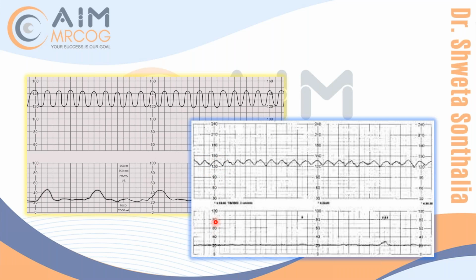And even if you can't read this, you start from 60. So 60, 80, 100, and then this is 120, and this is 140. Between 120 and 140, it is almost half of the boxes. So 20 beats is the total difference. This is approximately 10 beats.